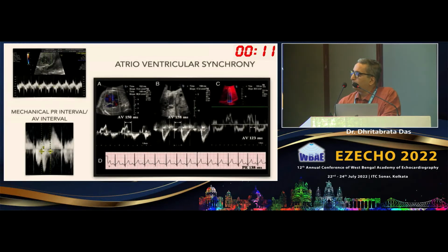One important aspect of fetal echocardiography is to determine the rhythm. Definitely we can't do an ECG in a fetus.